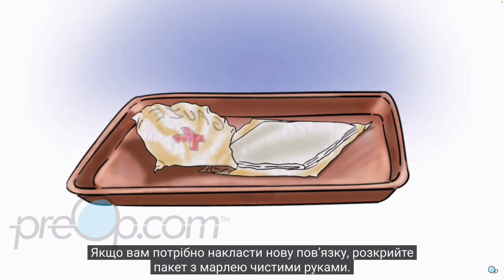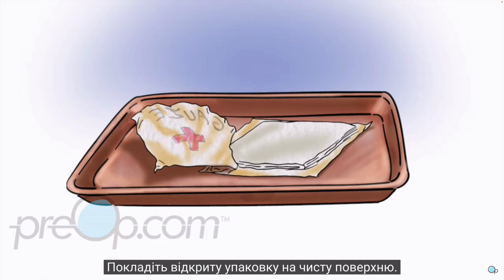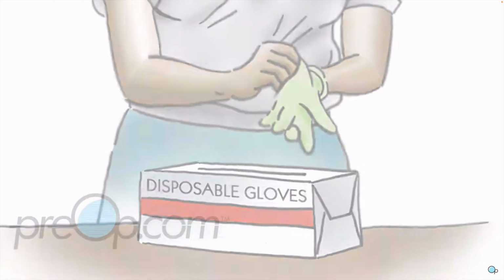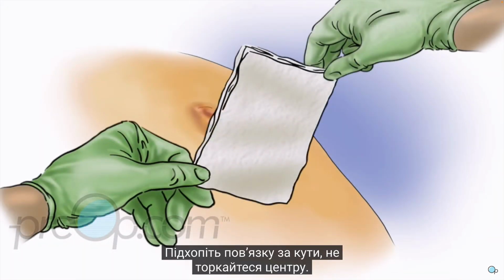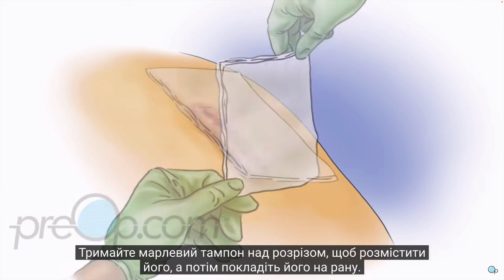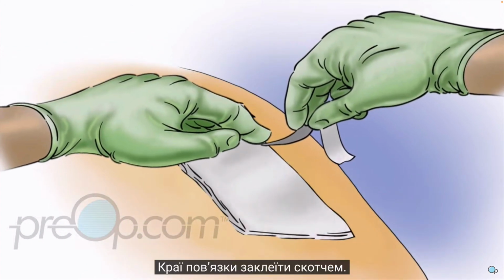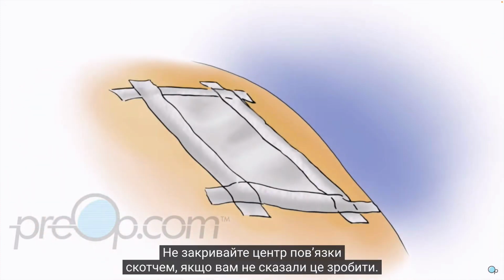If you need to put on a new dressing, open a gauze package with clean hands. Do not touch the gauze. Place the open pack on your clean surface. Put on clean gloves. Pick up the dressing by the corners. Do not touch the center. Hold the gauze pad over the incision to position it, then lay it on the wound. Tape the edges of the dressing. Do not cover the center of the dressing with tape unless you have been told to do so.